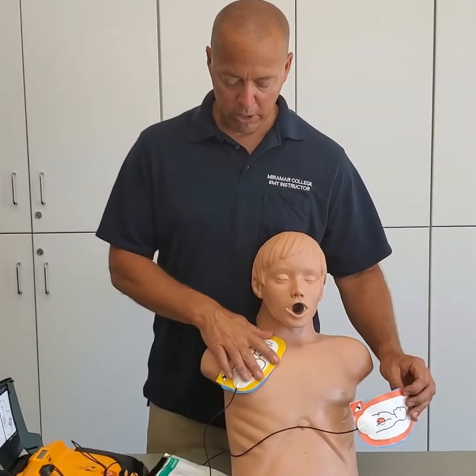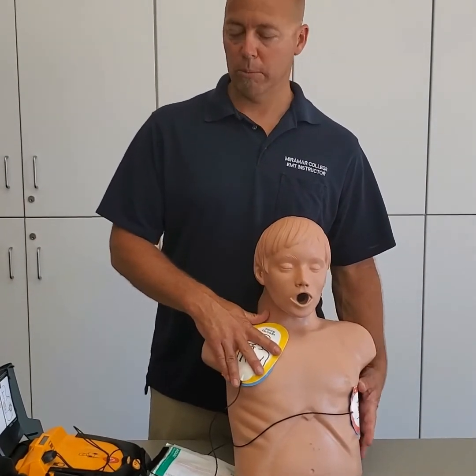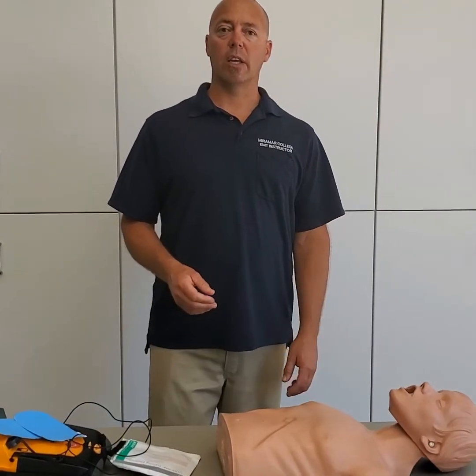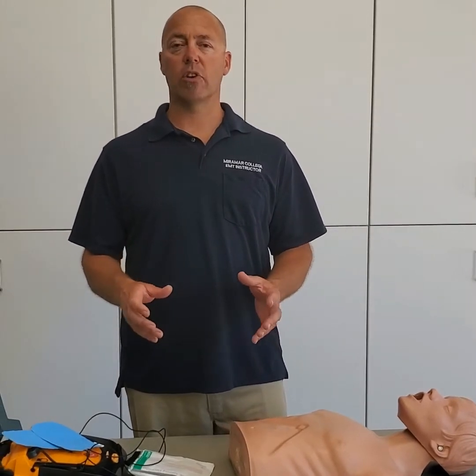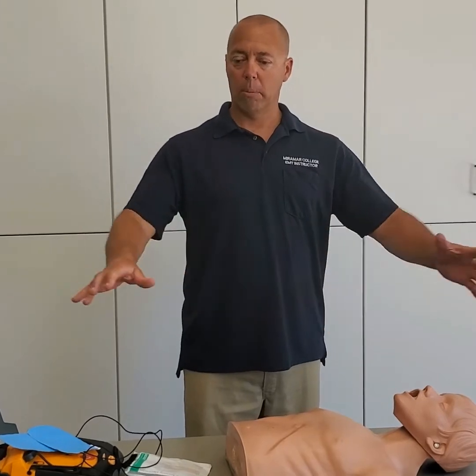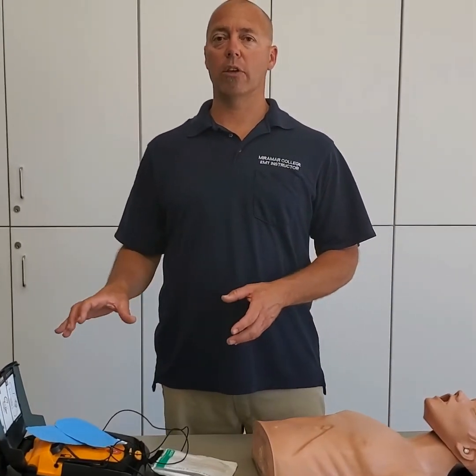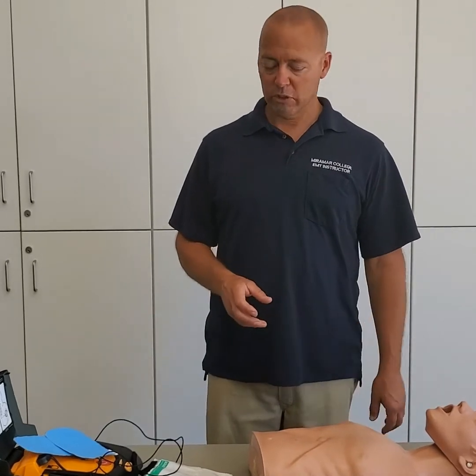Again, one pad goes in the right upper chest area and one in the left lateral ribs. Some considerations when we put these pads on: if our patient is in any standing water, so pools, ponds, things like that, we cannot apply the AED. We would have to get them out of the water, put them on a hard, flat surface, on dry ground, and dry our patient off. So we cannot use the AED if they're in any standing water.